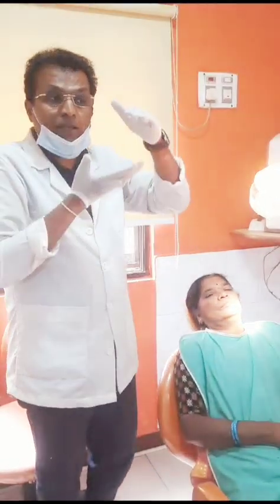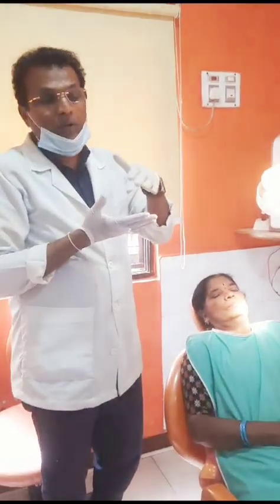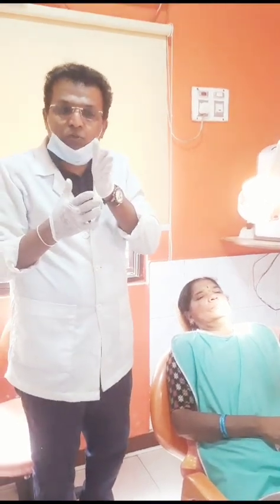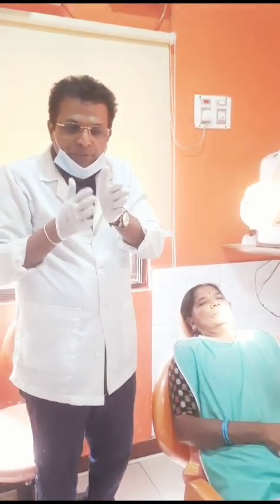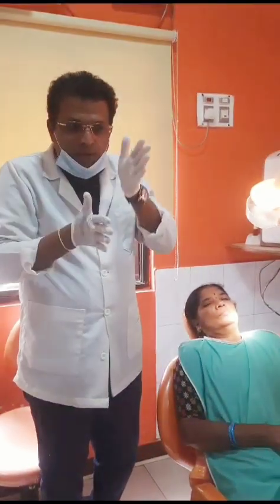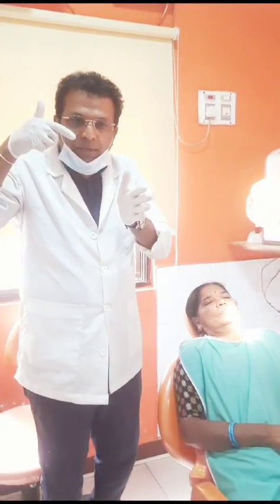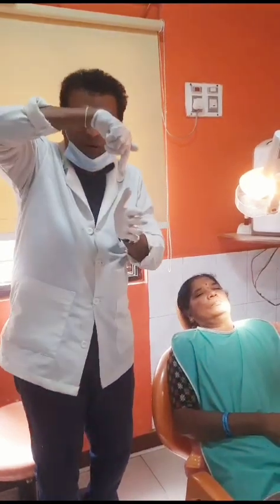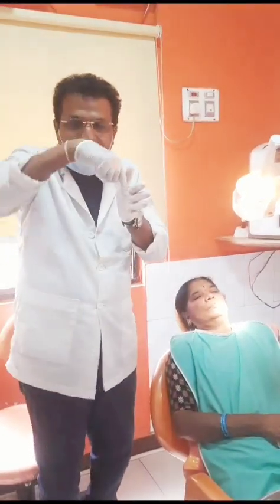They are placed in the cortical bone, that is below the alveolus. The only risk in the mandibular area, in the lower left area, is the mandibular nerve. We have to bypass the nerve. To bypass the mandibular nerve, we have two corticals — lingual cortical and buccal cortical. We take the implant obliquely and pierce either the buccal cortical or the lingual cortical, and then straighten it.